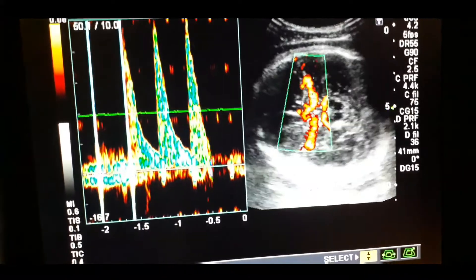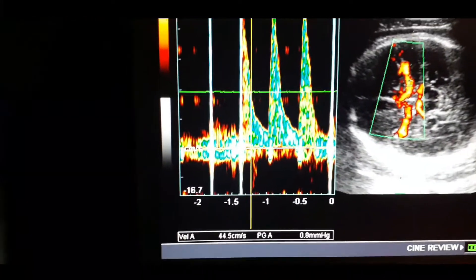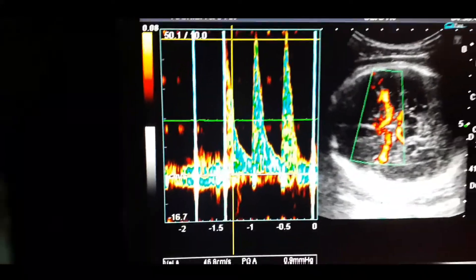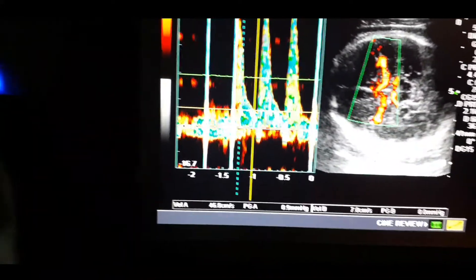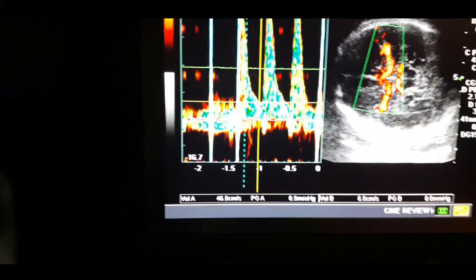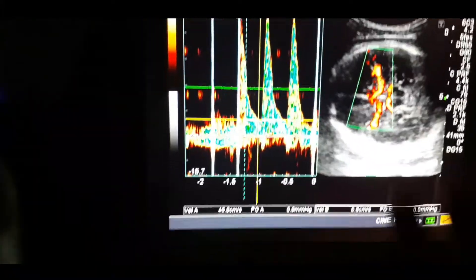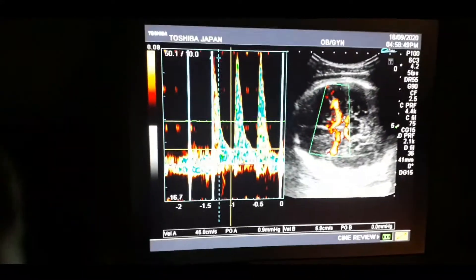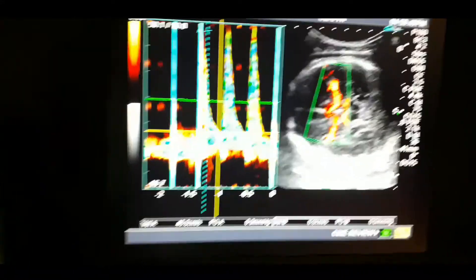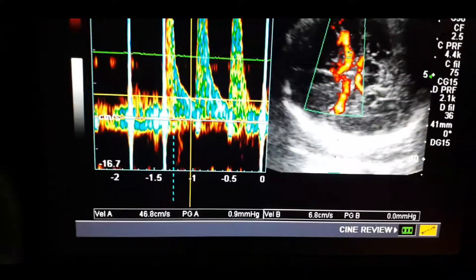This is due to the fact that the brain is more sensitive to blood supply. And if you calculate the S/D ratio, it is always more than the S/D ratio of the umbilical cord. The diastolic component is very small while the systolic component is the greater one.